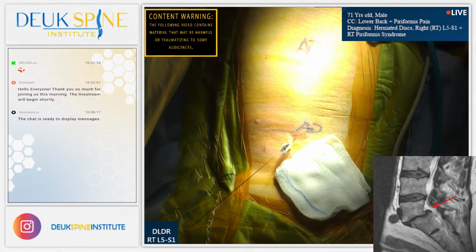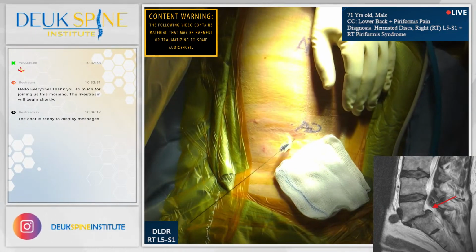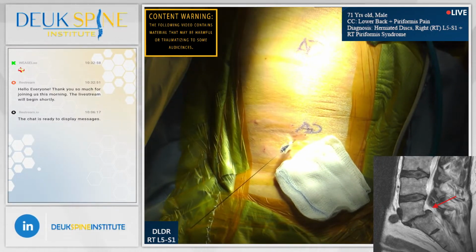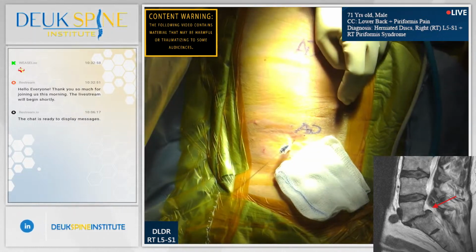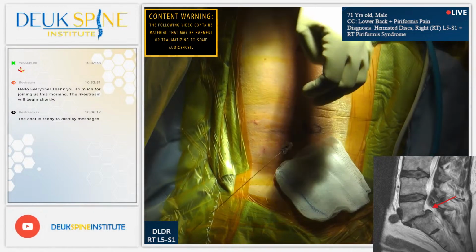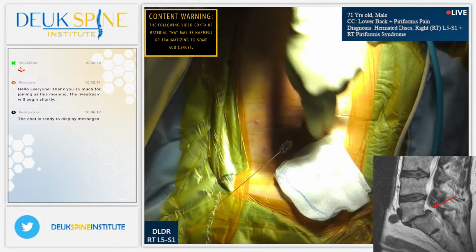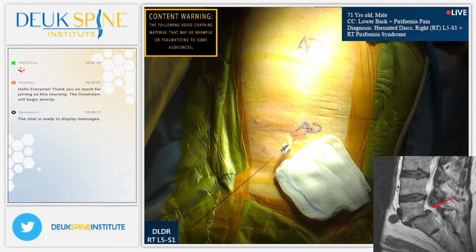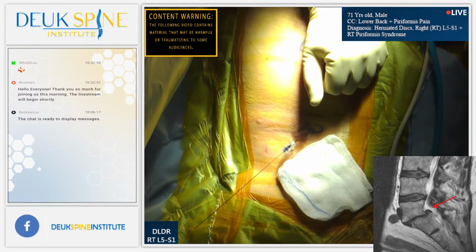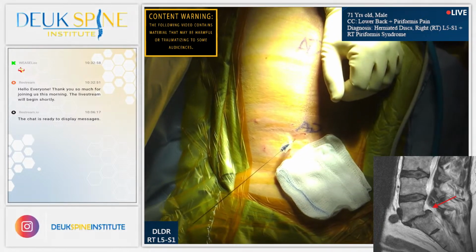So we're going to try the Duke laser disc repair at L5-S1, even though he's got a grade 2 spondylolisthesis. We have placed our needle into the disc, and if you look at his MRI, the nerve root is getting just crushed on the right and left both. But he only has right leg pain, but he's got weakness on both sides from pinched nerves at L5-S1. So I'm going to try to make some room in there for the nerve root, get the pressure off the nerve root, buy him some more time.